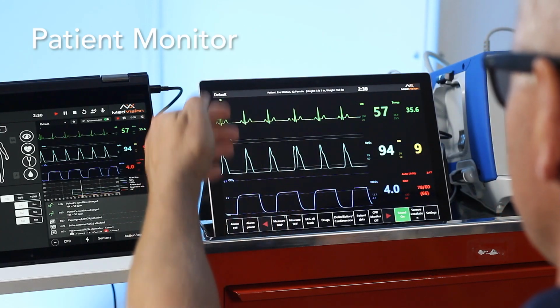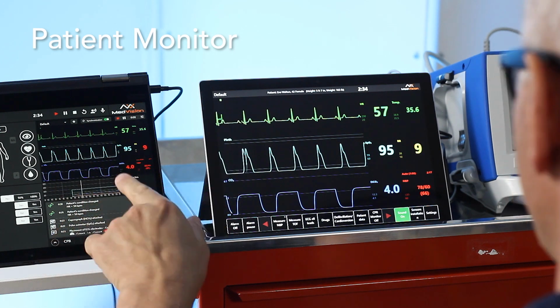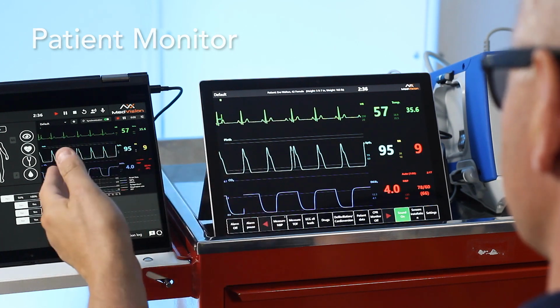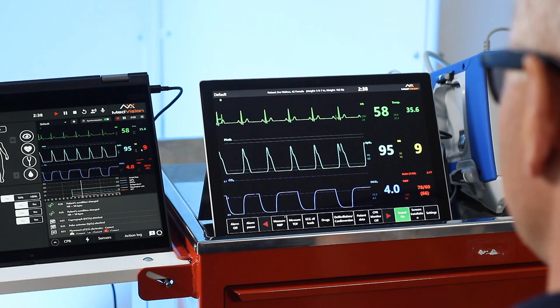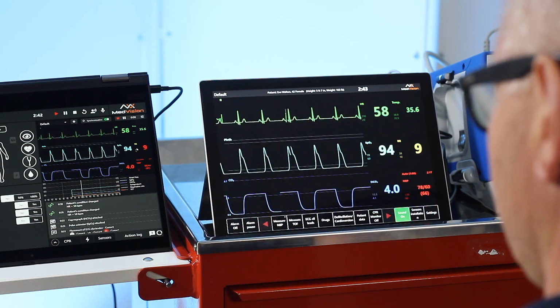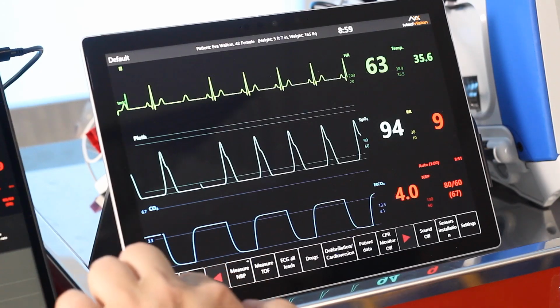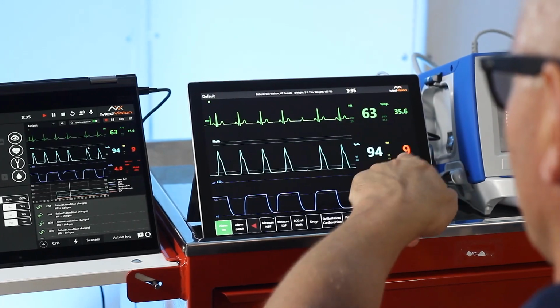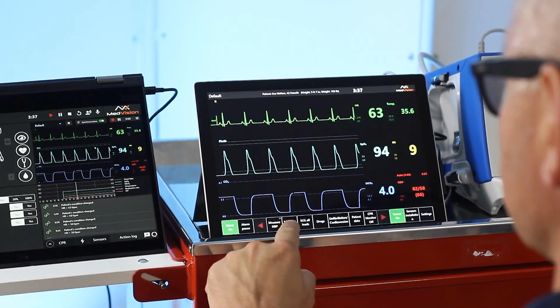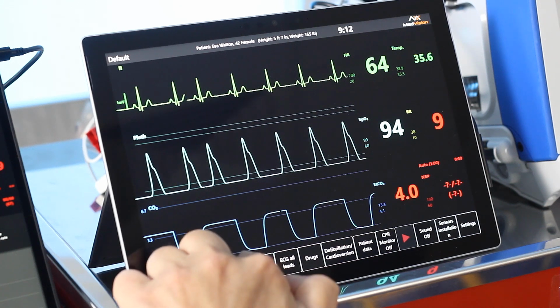As you can see, this monitor layout is representative of the instructor one. So whatever I see, the candidate will see. Change your parameters on the instructor application and they are replicated within the patient monitor. There are some quite unique features for Leonardo. You can have the alarms on and off, so they're currently off. We've got some abnormal values outside of the limits that are set. We can pause that alarm for 2 minutes, or we can switch that alarm off.